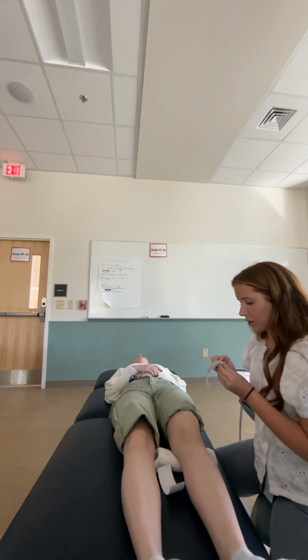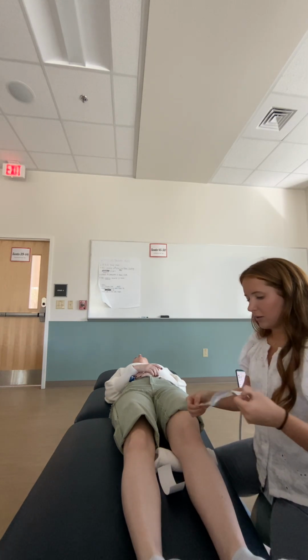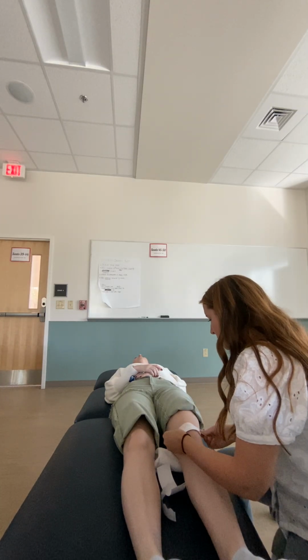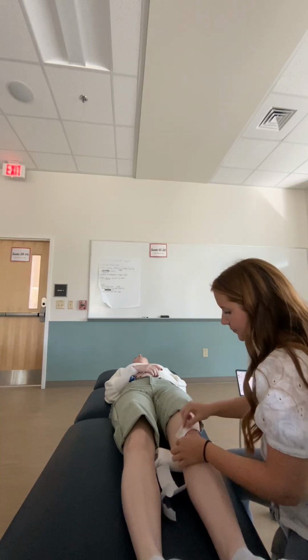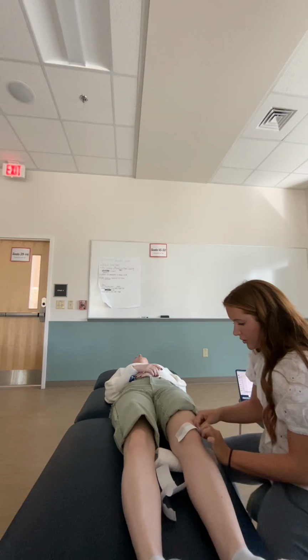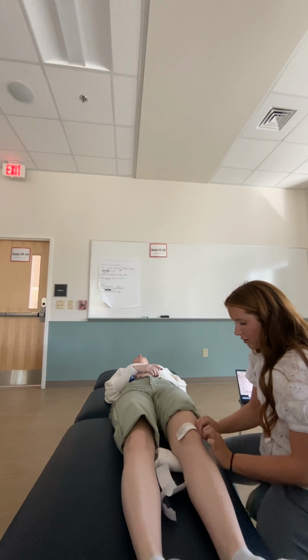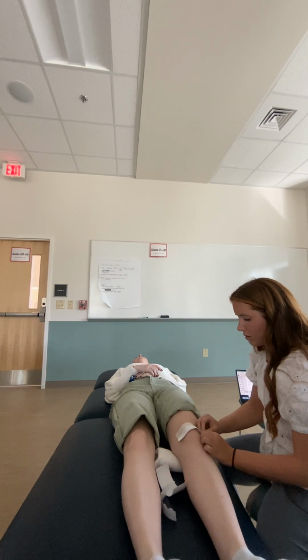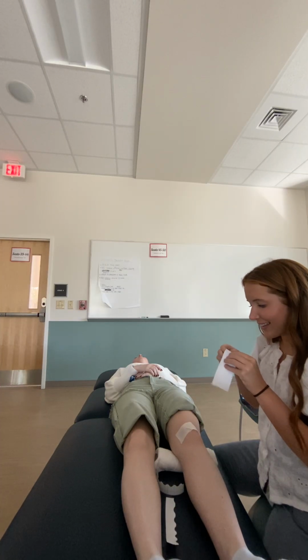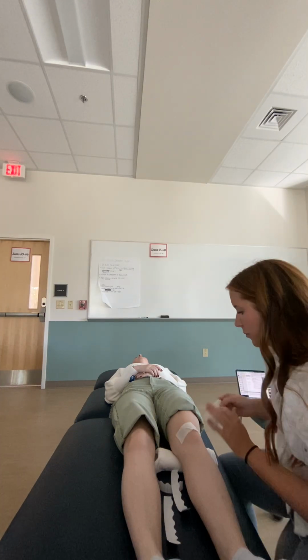Okay. So as I said, this just sits on your kneecap. And you're gonna notice there's some wrinkles in it, and that's okay. This is just like an anchor. Okay. Does that feel okay? Yeah. And then we're gonna put one more piece down.